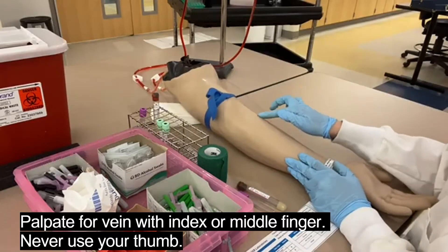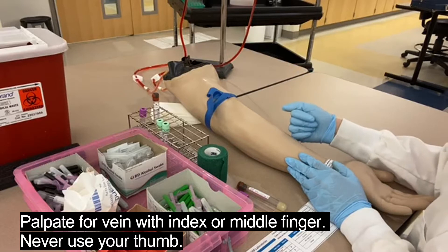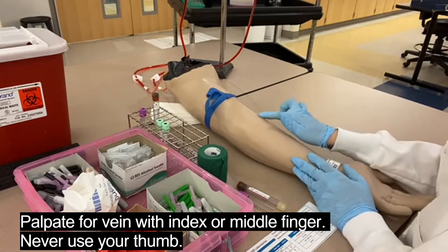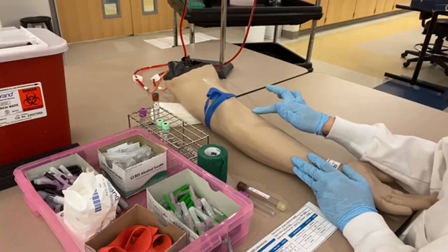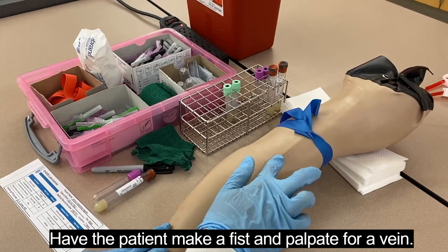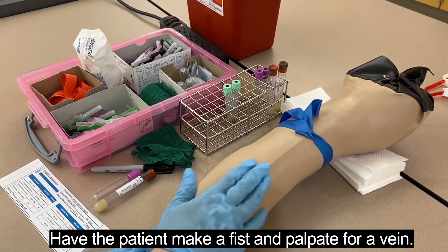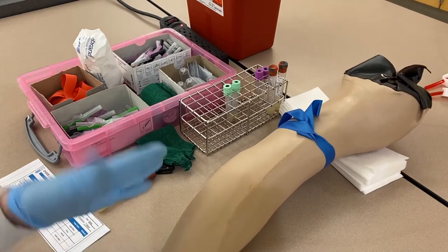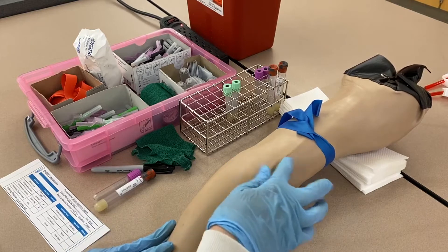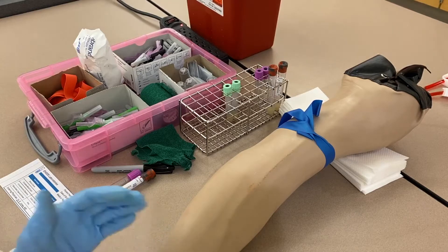Palpate with your index or middle finger — never your thumb. Your thumb has a pulse, and you can't tell if it's your pulse or the patient's pulse, so you don't want to accidentally stick a needle into something with a pulse. Have the patient make a fist if they're capable and palpate for the vein. It should feel spongy and trampoline-like. Track the direction of the vein since it can jaunt off to the side. You can move the patient's arm to straighten the vein. Find visual landmarks — a mole, a wrinkle, or in this case track marks — to help relocate the vein.